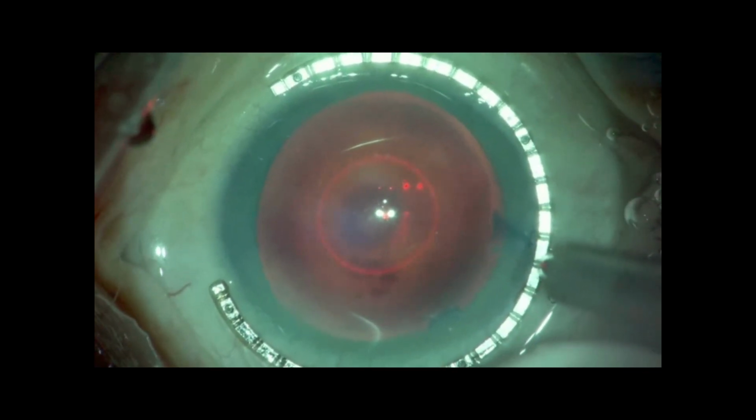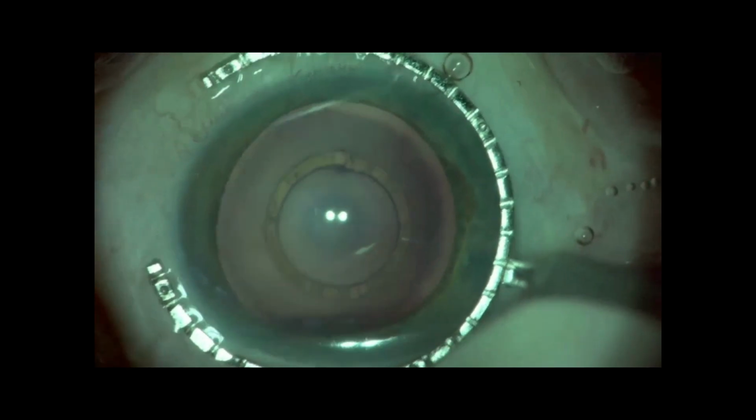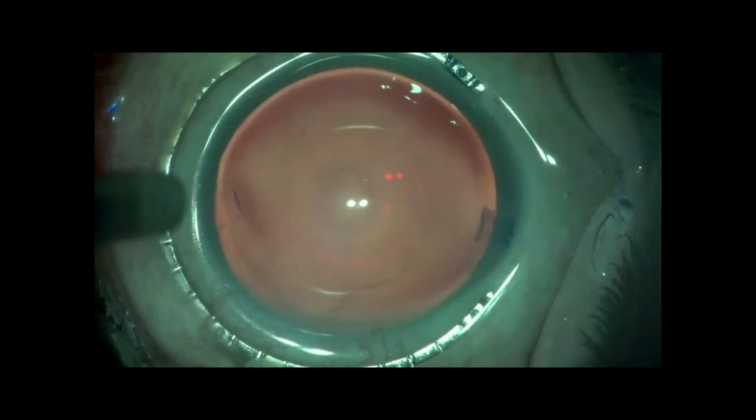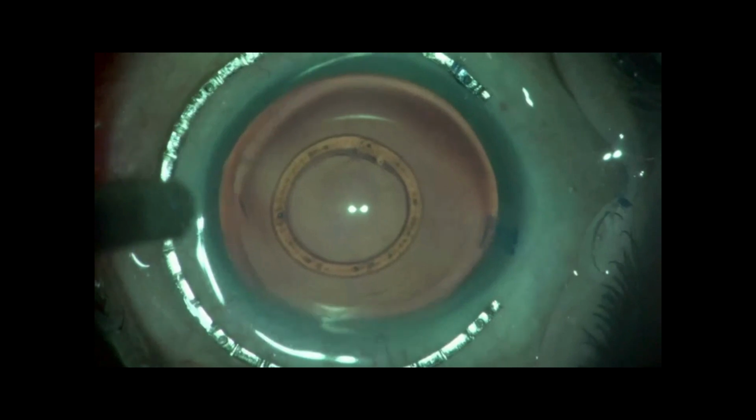Just have a look at some capsulotomies here. We'll actually look at a full case in a moment, but the capsulotomy is done in 1/3 of a second, centered on the Trypan landmark.